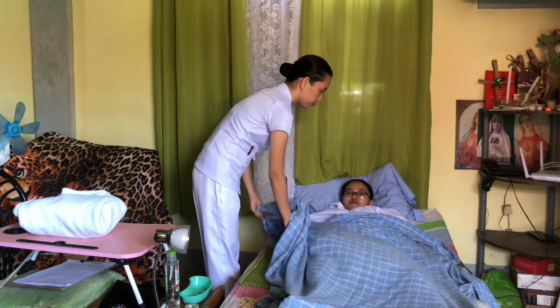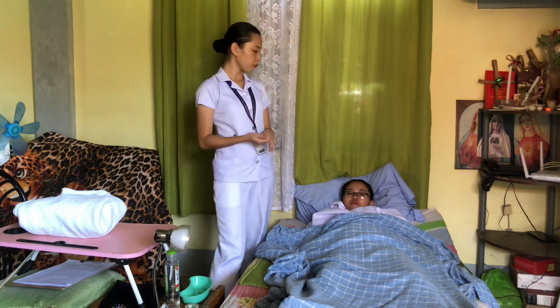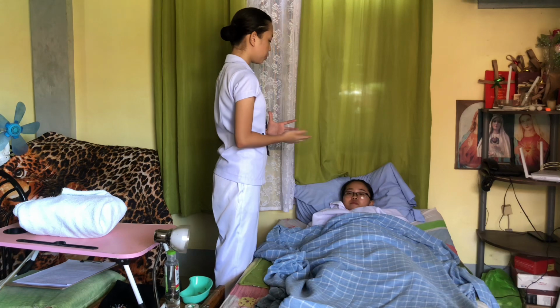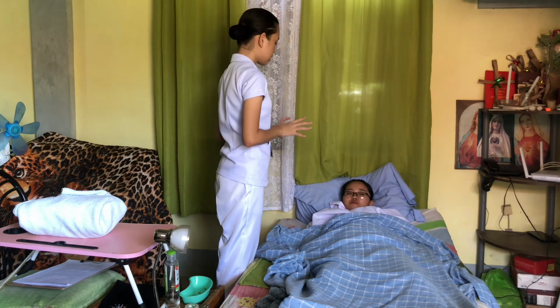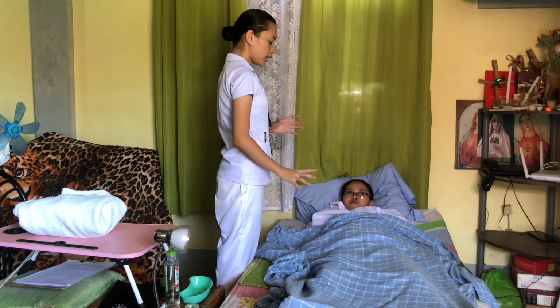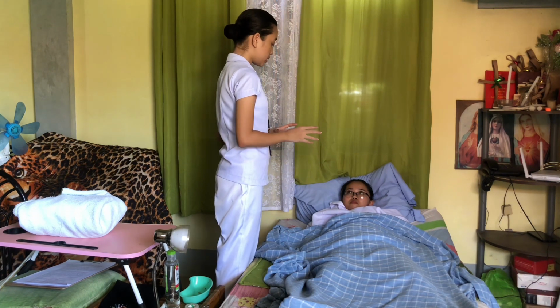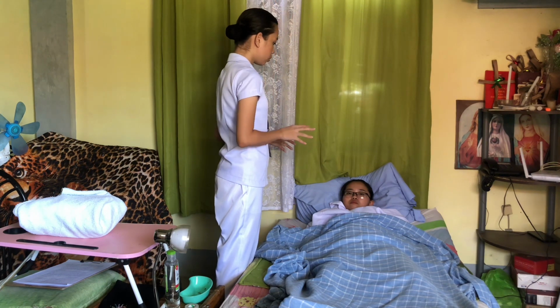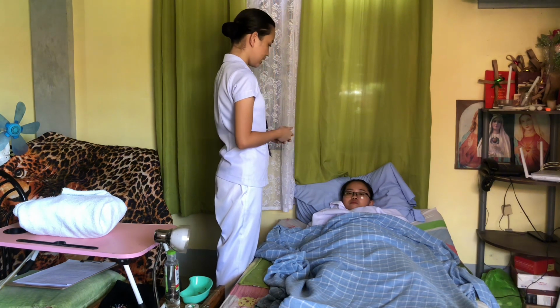Okay, thank you. After that, we are going to explain the procedure to the patient so that the patient will be well aware of the whole procedure and also for them to cooperate well. So today, ma'am, the procedure we will be doing today is the urinary catheterization, and it is on the physician's order. And so what I am going to do, ma'am, is I am going to insert a tube through your urethra and connect it to your bladder so that you can excrete your urine.